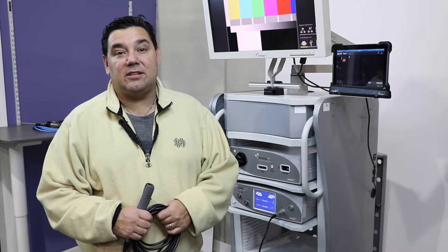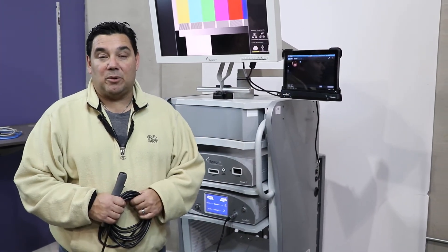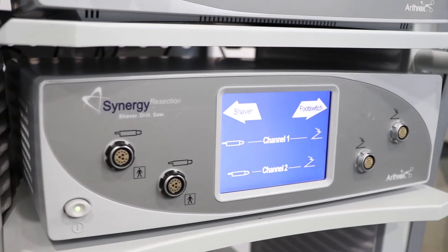In addition to the Synergy HD3 video platform, Arthrex also has the ability and capabilities to have the Synergy resection system. To operate the Synergy resection system, you have a hand control shaver or foot control shaver.